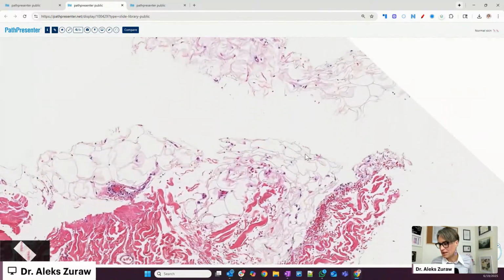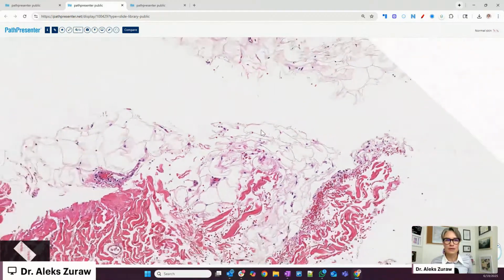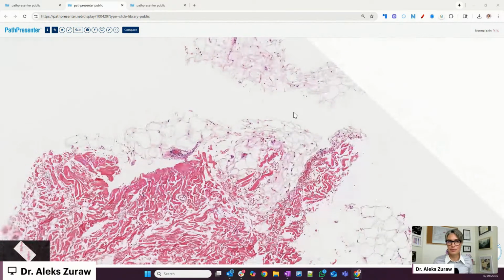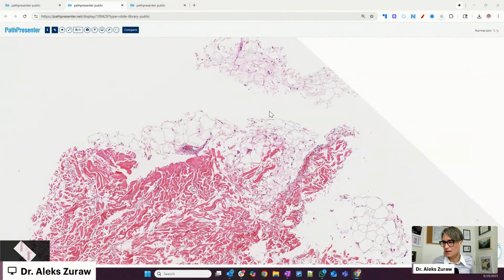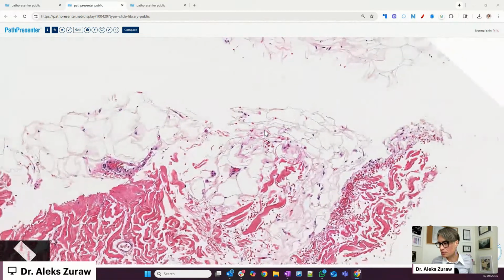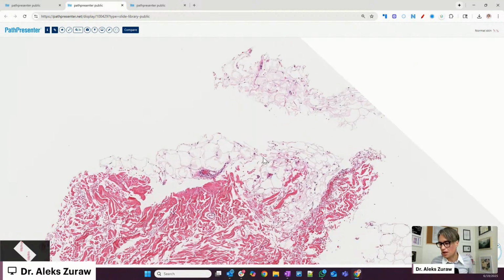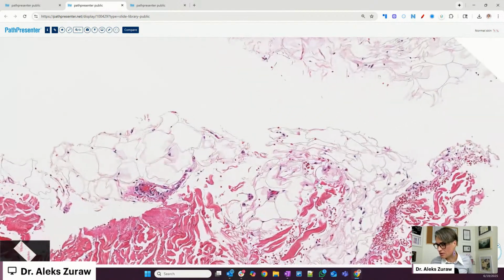And now under the dermis is the so-called hypodermis, also known as subcutaneous tissue, and this is fat, adipose lobules, so fat separated by septa, and we have also blood vessels and nerves there. I am not seeing any Pacinian corpuscles. These are very typical, onion-like looking receptors for pressure, but I do see fat cells.